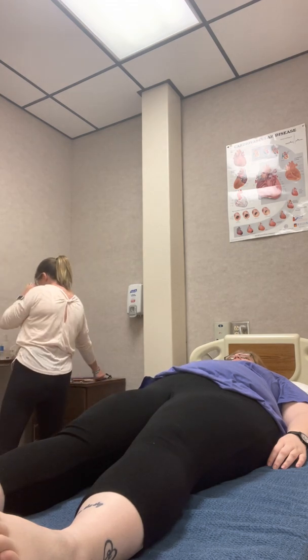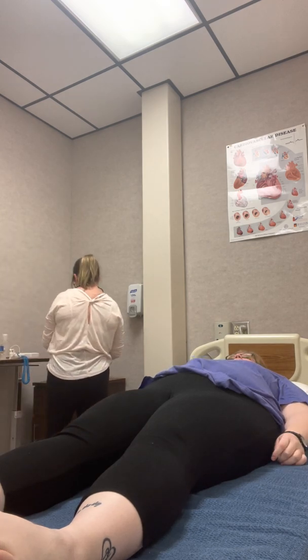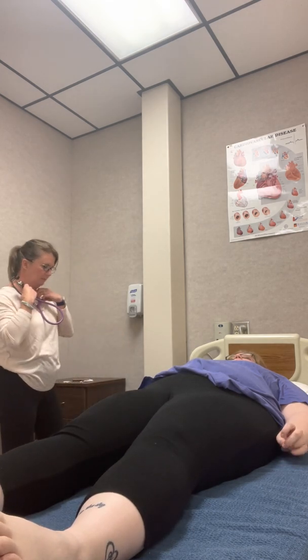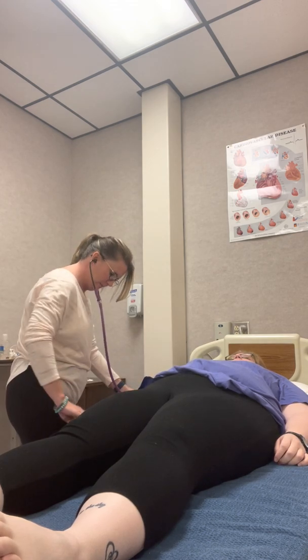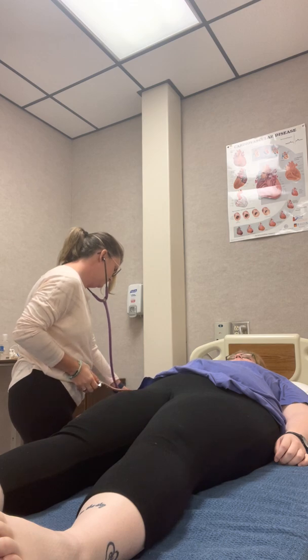But you're done there, so your respirations are good. Pulse, oxygen. Now I'm gonna get your blood pressure, so I'll have you sit up, please. While I'm doing that, I'm just gonna let this hang out in your finger. Is it okay if I do it from this arm? You had no surgery on this arm, correct? There's no polish on it. Is it particularly cold? No, not really.